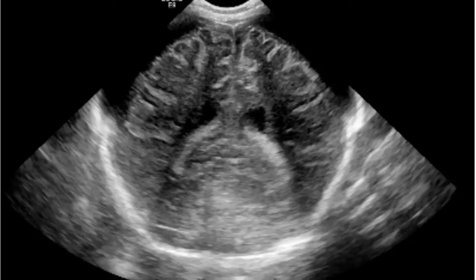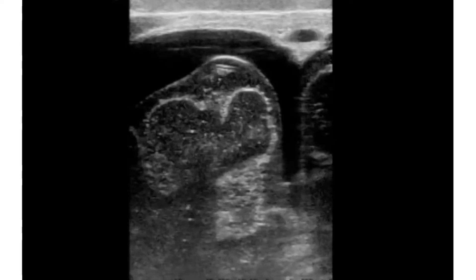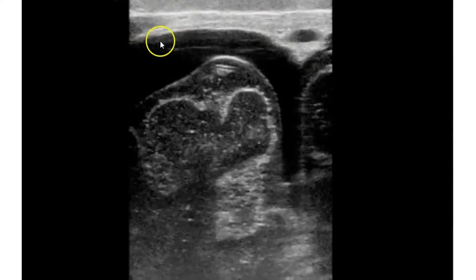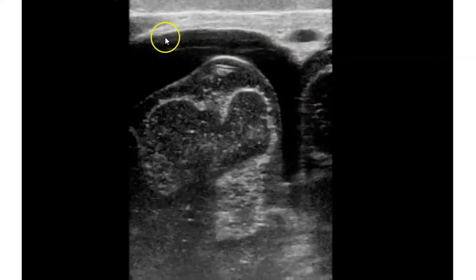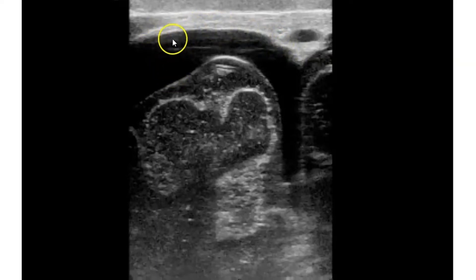This patient has some anechoic fluid right here. Moving on to the next image — this is with a very high-res linear probe. Here you can see the layers. This is an anechoic fluid collection here, extra-axial, but more specifically it's subdural. This is the dura — this echogenic white line right here is dura. So any fluid or blood, but this is fluid, below that would be subdural — so subdural fluid.